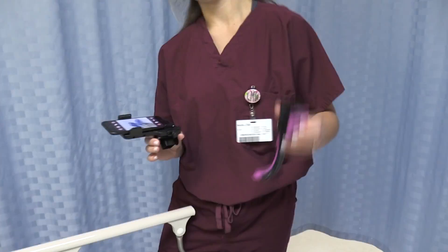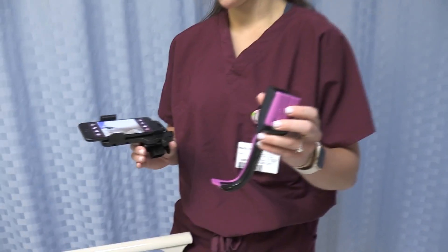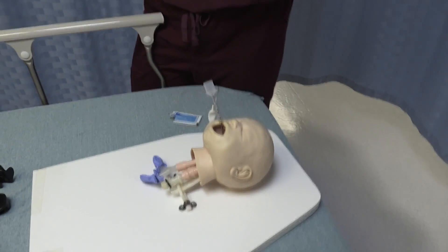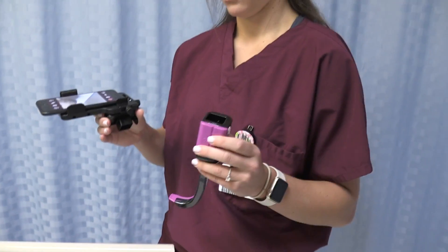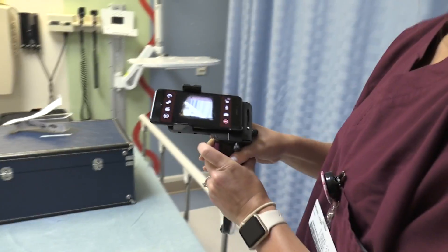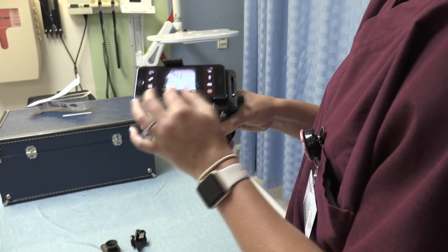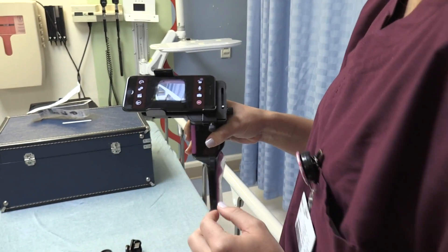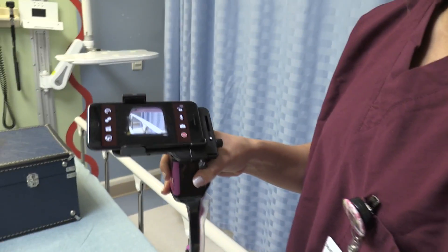Let's go ahead and hook up our AirTrack SP disposable blade. We have the pediatric size AirTrack SP even though we have a neonatal mannequin. We're going to place it directly on top and just slide it in. Now you can zoom in and out as you like, and it's ready.